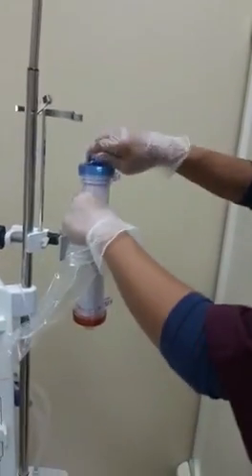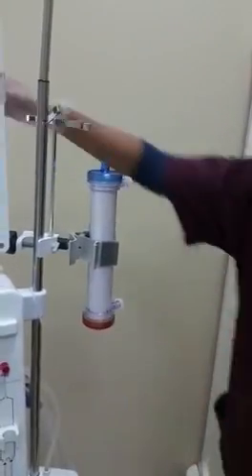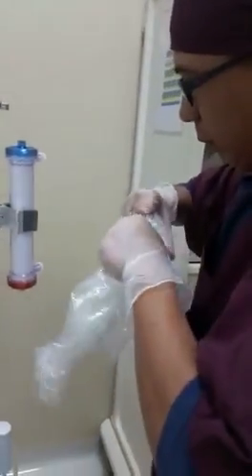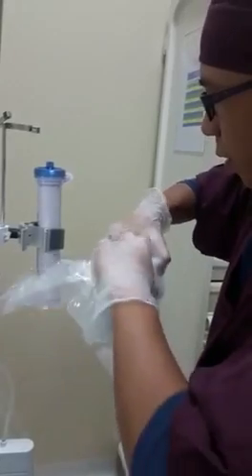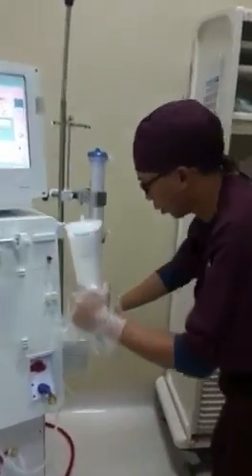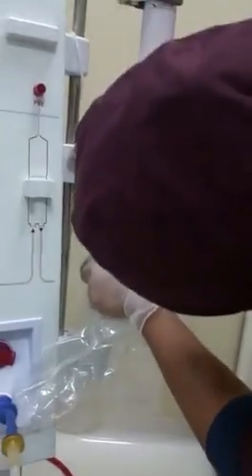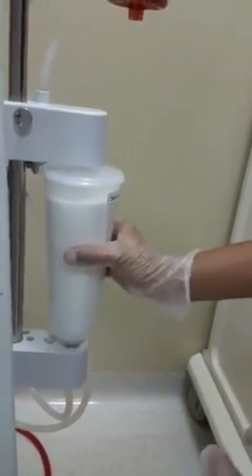Then the dialyzer, blue side up. After that, we will connect the sodium bicarbonate canister by pressing this lever and pulling it up, then pushing from down and pressing down. It should be movable but secure at the same time.